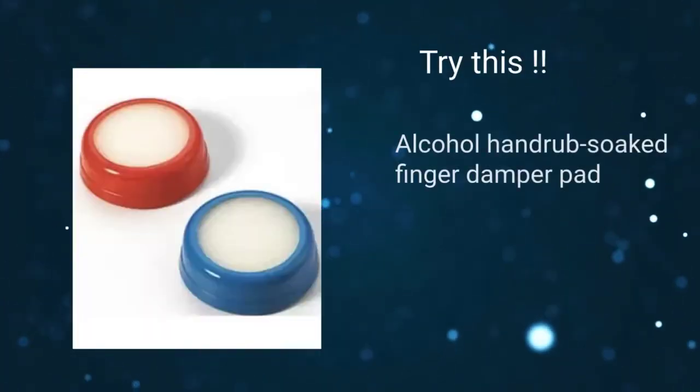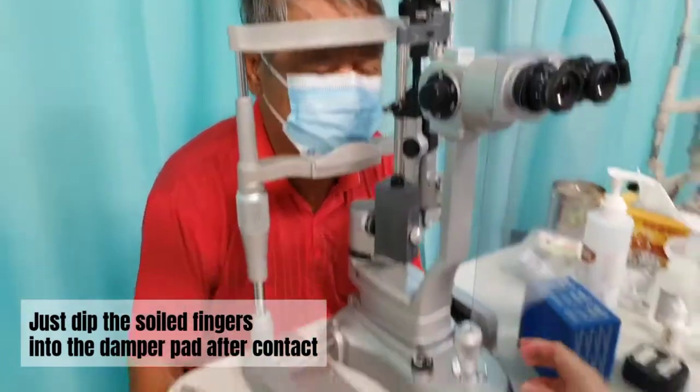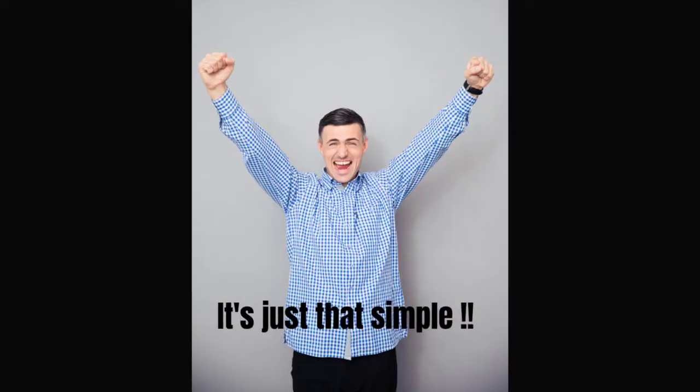This is an alcohol hand rub soaked finger damper pad. Just dip the soiled fingers into the damper pad after contact with the patient. It helps to prevent soiling of the slit lamp parts. It's just that simple.